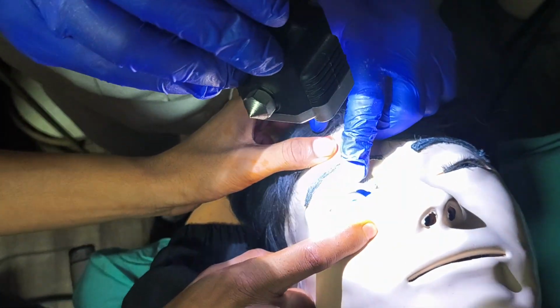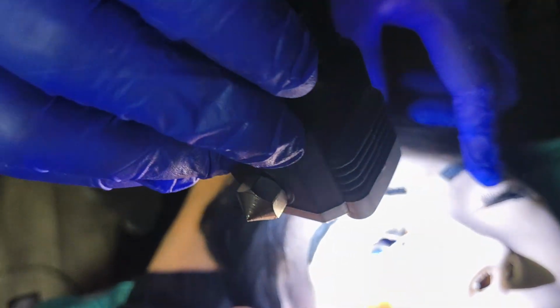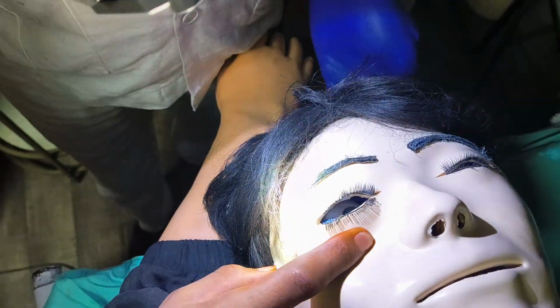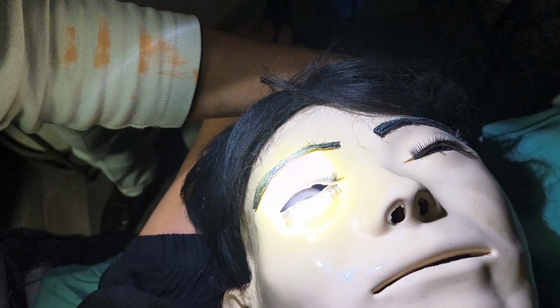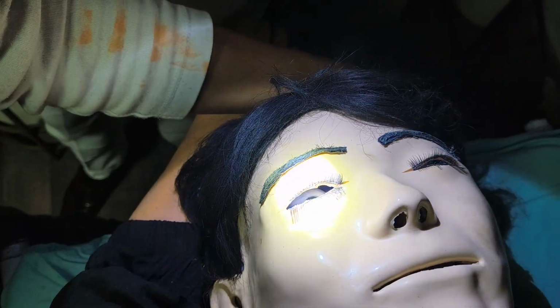This is head injury, and the pupil is dilated. Okay. So this is in D. And once we have resuscitated, eye movement returns. So it can move its eyes. So you have resuscitated. Now he is moving his eyes.